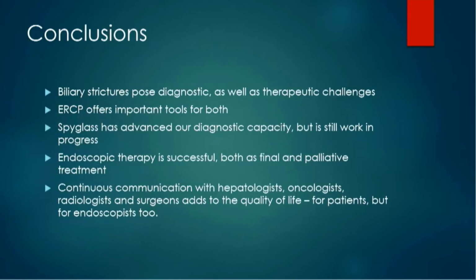So to conclude, biliary strictures do pose diagnostic as well as therapeutic challenges, and ERCP has become a diagnostic modality again for the sampling options. And Spyglass has advanced our diagnostic capacities also, although we still do not have all the answers. Endoscopic therapy is successful as final therapy, but also as palliation. And we obviously need to keep closely connected to our hepatologists, oncologists, radiologists, and surgeons to add to the quality of life for the patients and also for ourselves.